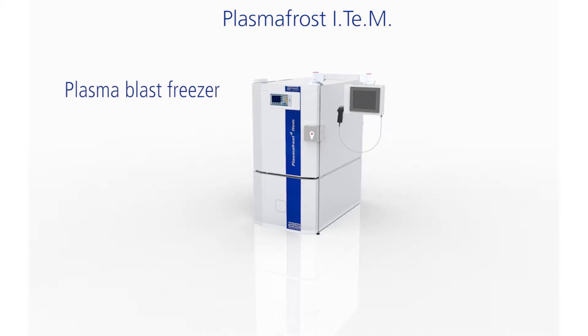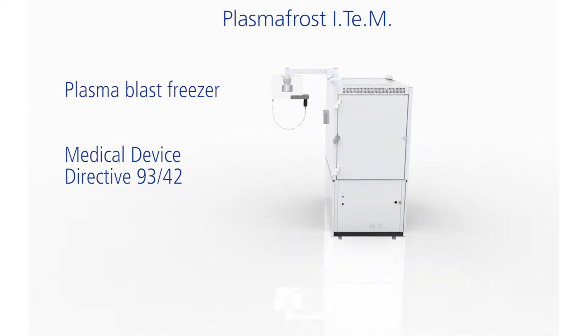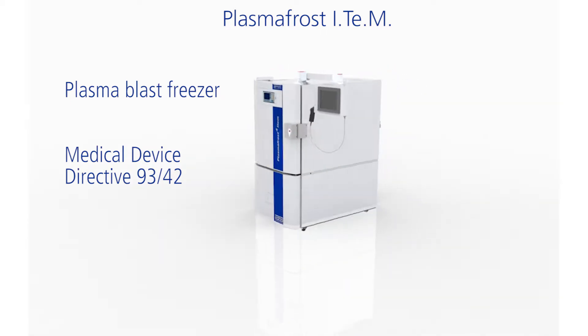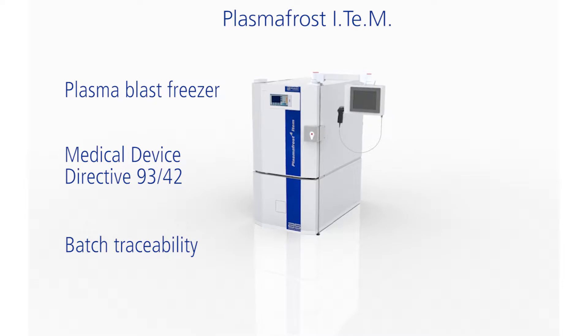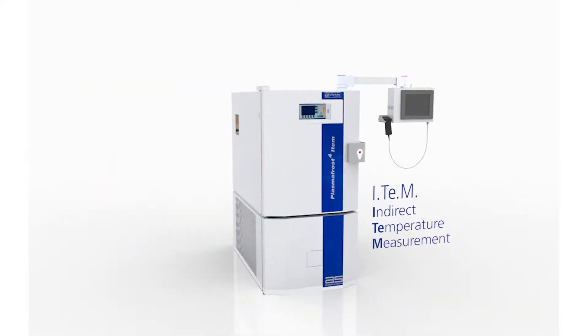Plasma Frost Item is a plasma blast freezer, certified as a medical device in accordance with the European Directive 93/42. Plasma Frost Item allows the certification of each batch of frozen plasma, thanks to an indirect temperature measurement system.